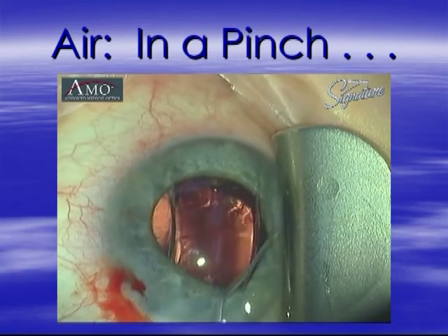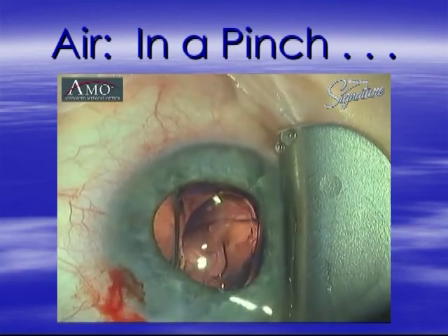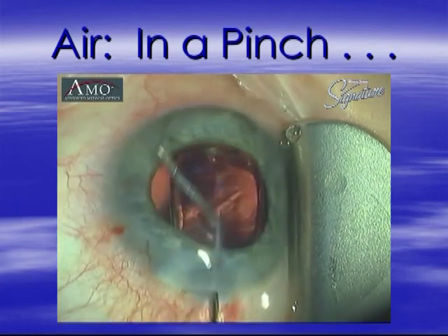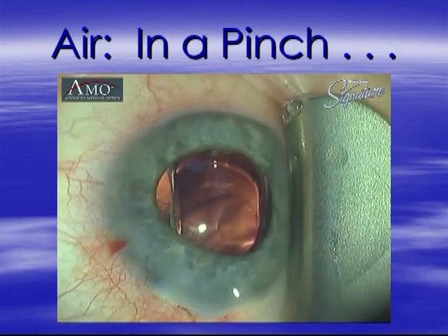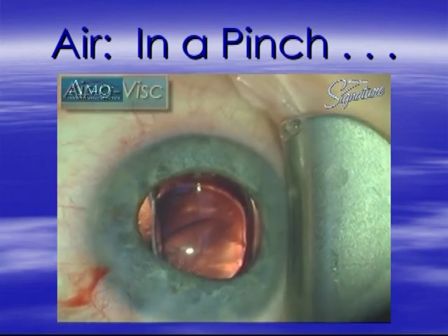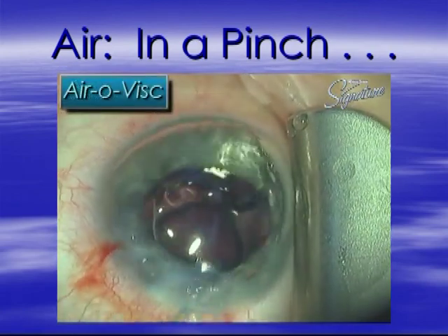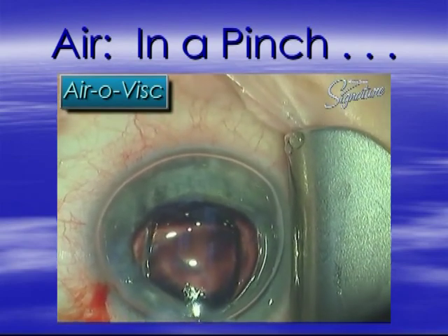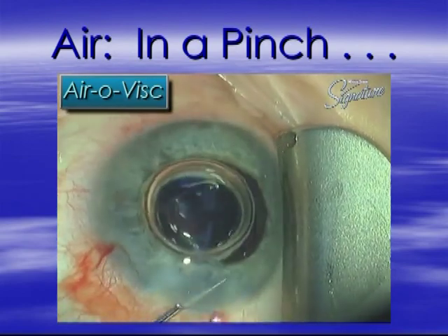Well, first we're going to irrigate out from underneath the IOL. We're going to irrigate the anterior surface. And as we irrigate the chamber angle, we can really see the admixture of viscoelastic and BSS clearly visualized in the red reflex. Well, to confirm that I've removed the viscoelastic from the anterior chamber, we're going to put in Aerovisc. Aerovisc, the viscoelastic of choice.